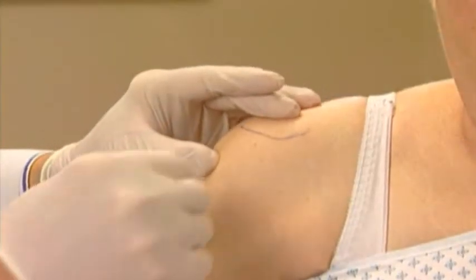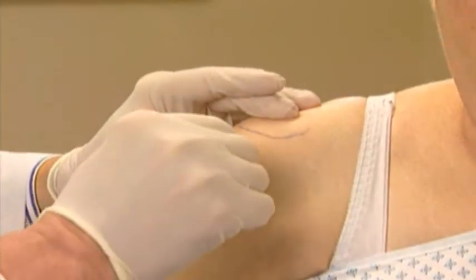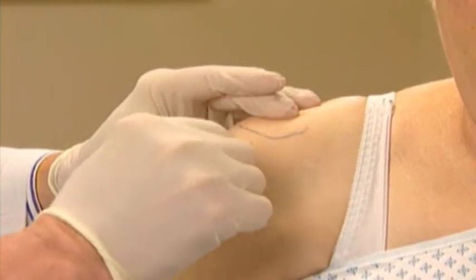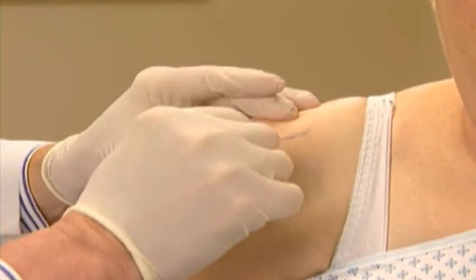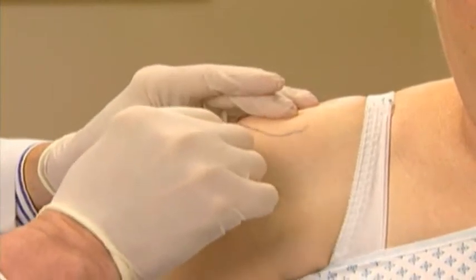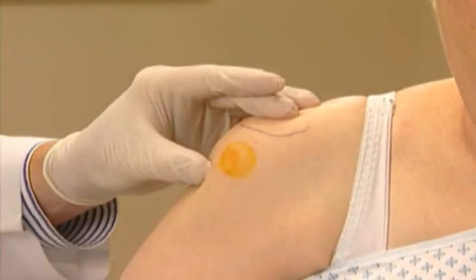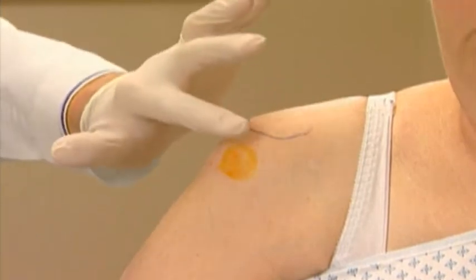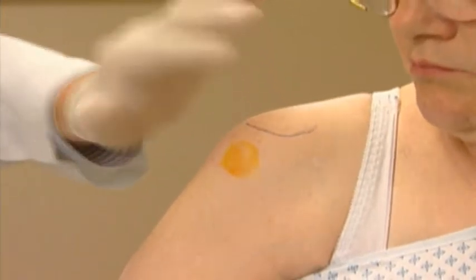The injection site is prepared and cleansed with a topical antiseptic. The initial injection is made approximately one finger breadth below the lateral edge of the acromion process.